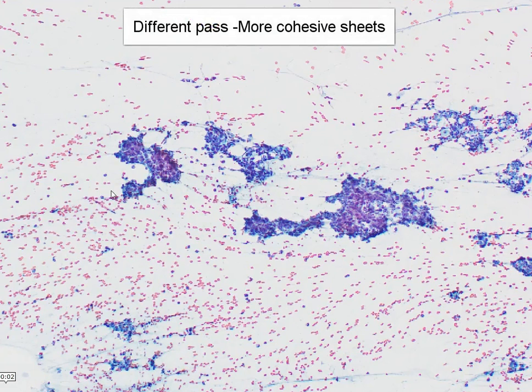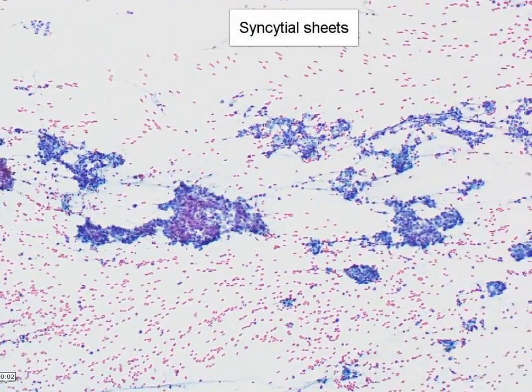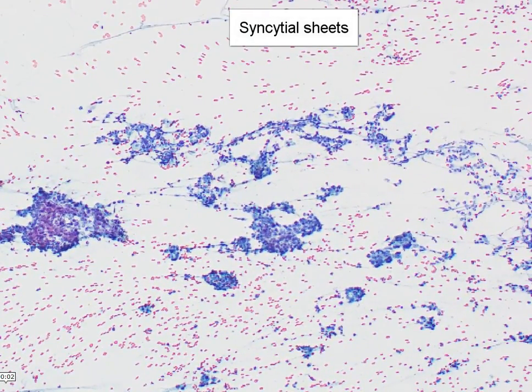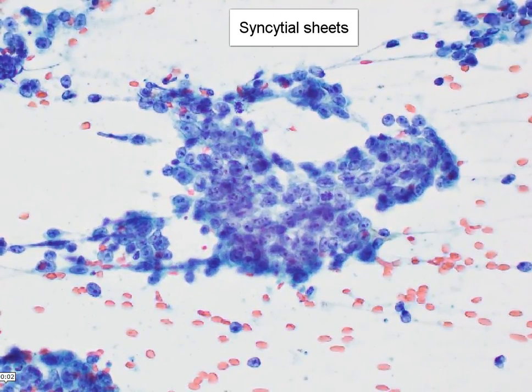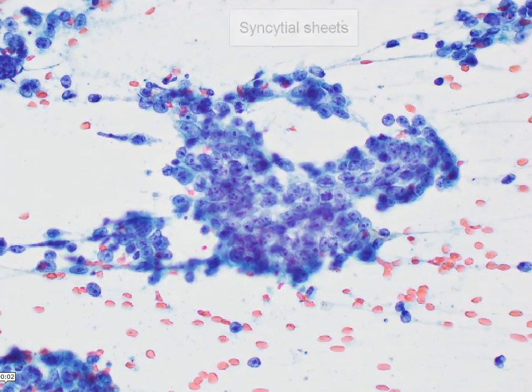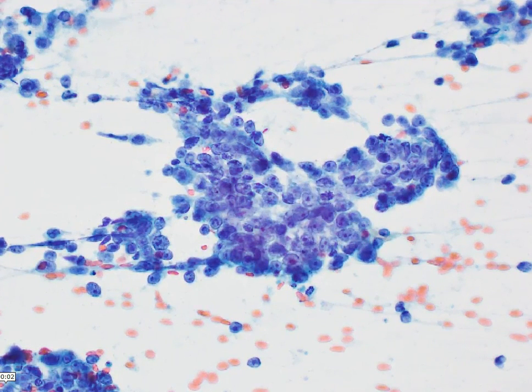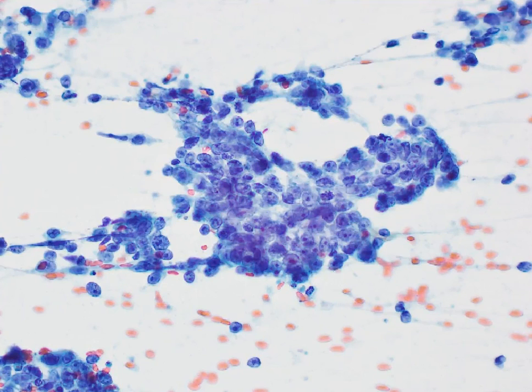This is taken from a different pass, and here we can appreciate that there is more cohesion, and what we are seeing are syncytial sheets of these malignant cells. As we move along, we can see that there are some very well-formed tissue fragments. When we focus up and down, we are actually able to see that there is quite a bit of crowding and overlapping of the nuclei. There are no really distinct cytoplasmic outlines where we can see where one cell stops and the other cell starts. This is what syncytial means — it is quite a disorganized group.